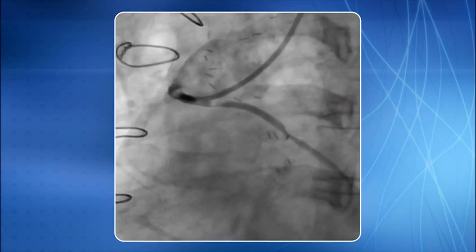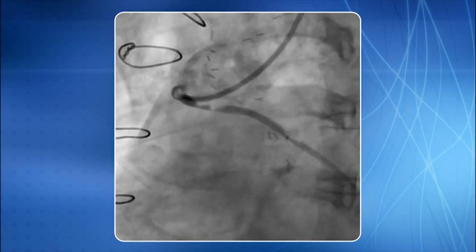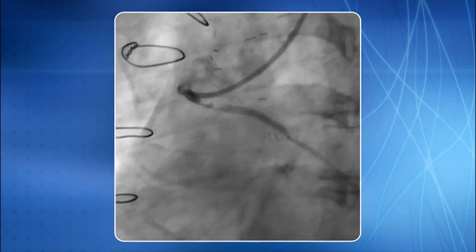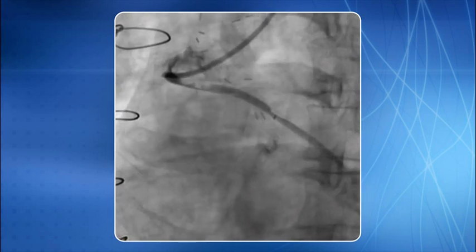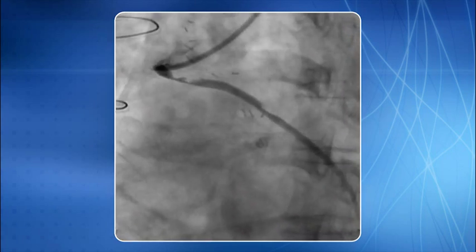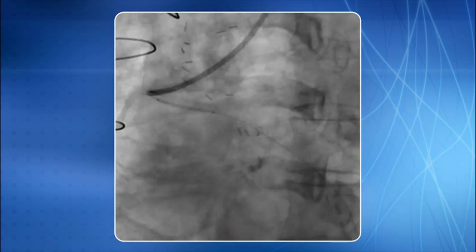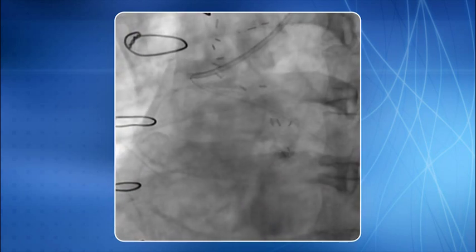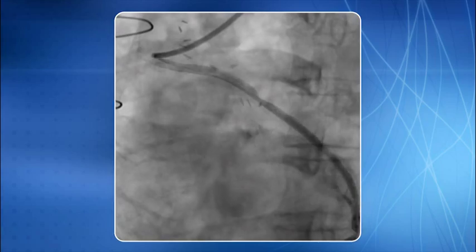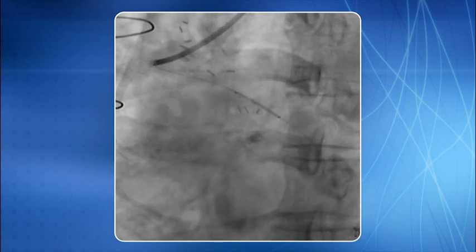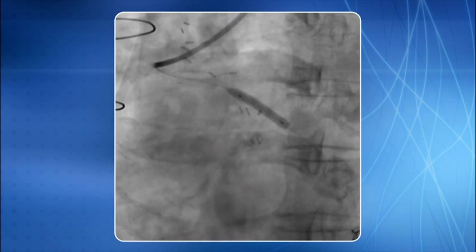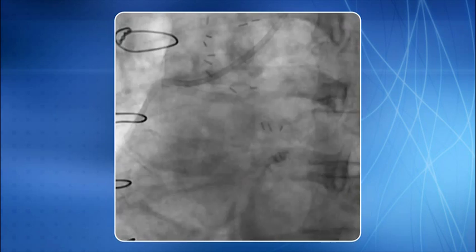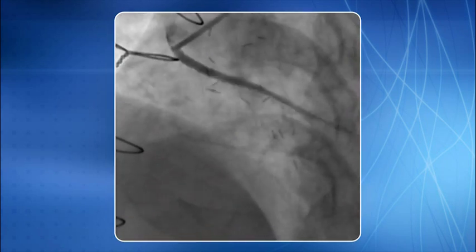In this patient, intervention of two separate lesions in the SVG to OM was performed. The graft was cannulated using a 6F JR4 guide catheter and the lesions were crossed using a 0.014 inch BMW PTA wire. The first stent was deployed in the proximal lesion with an optimal result. Deployment of the second stent in the distal lesion followed, and the end result is satisfactory.